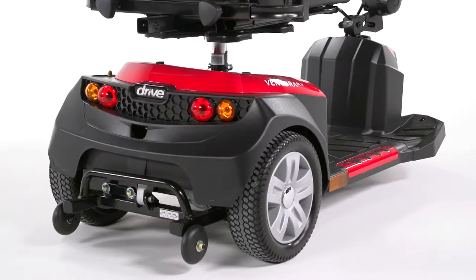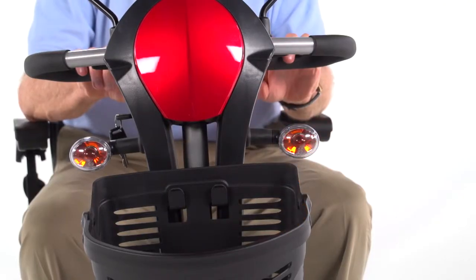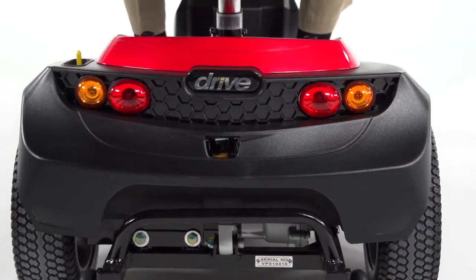Plus, the ride comfort is enhanced with rear suspension. In addition, the 3-Wheel Deluxe model adds front and rear turn signals.